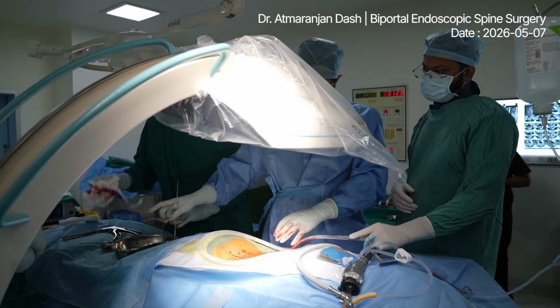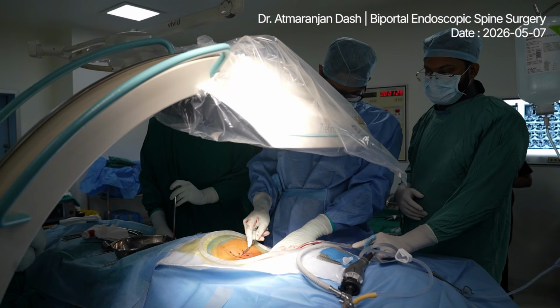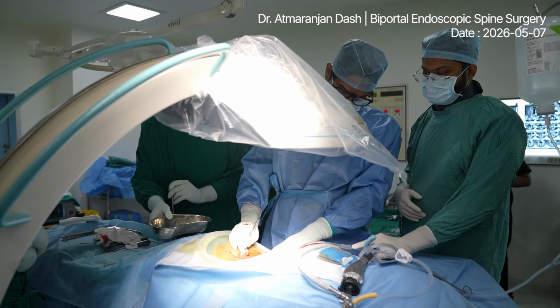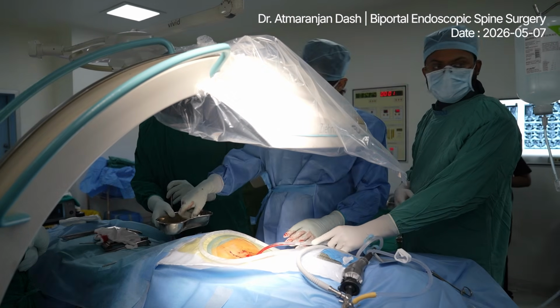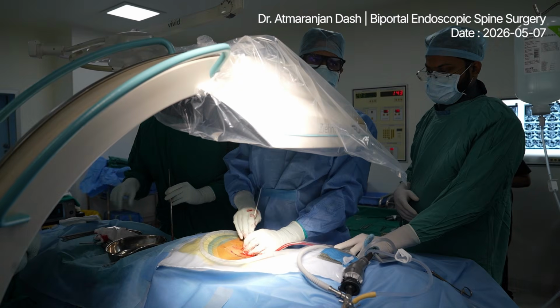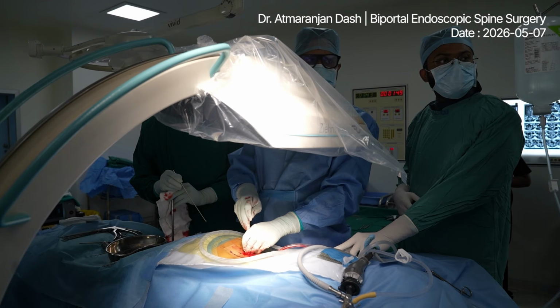Once it is done, take another mark in the inferior area. You can take it on the pedicle, or anywhere you want depending on the pathology. So this is the second incision, directly on the inferior TP. TP landing is an easier way of doing the surgery. Shoot. Again on the same area, shoot.